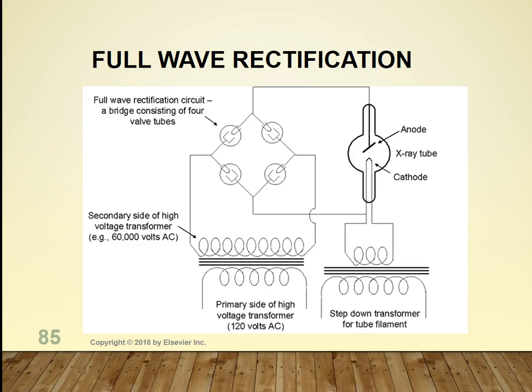If you have a standard 60 Hertz generator with 60 Hertz of incoming power and it's fully rectified and then gone through a capacitor bank where it's smoothed, then there is near constant potential provided, and that is what you want. You don't want to try and take an X-ray where you've got bursts of electricity. You want constant potential for that X-ray to be made.